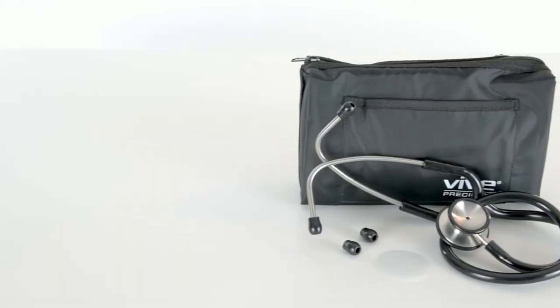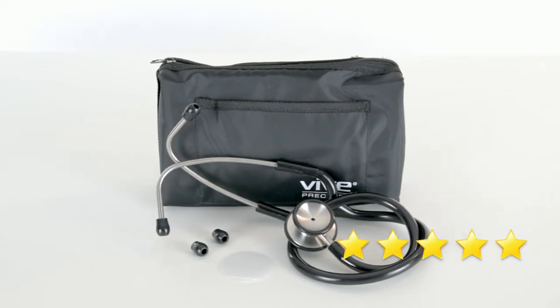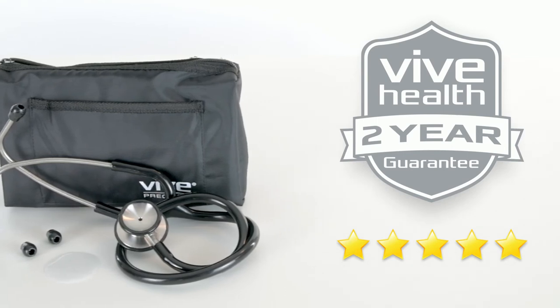The Stethoscope by Vive Precision is trusted and proven. Check out the 5-star reviews. Plus, it's backed by an unconditional 2-year guarantee. You can't beat that anywhere.